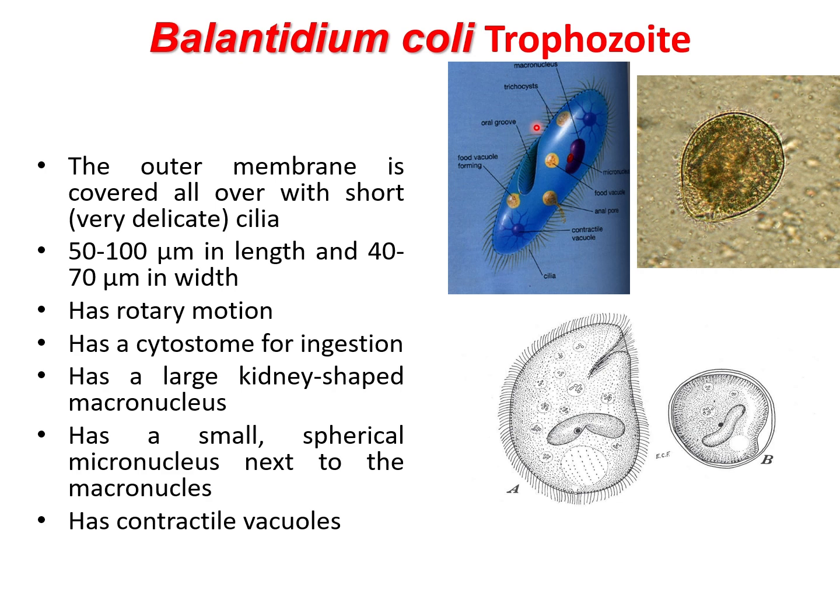Basically, the trophozoite of Balantidium coli is big in size. It is surrounded by cilia that beat all over the surface. The trophozoite contains two contractile vacuoles that regulate the osmotic pressure. These have an oral groove to allow ingestion of food. Evacuation of waste happens by fusion of vacuoles to a certain area in the trophozoite that is called the anal pore or cytoproct, knowing that the oral groove is called cytostome.